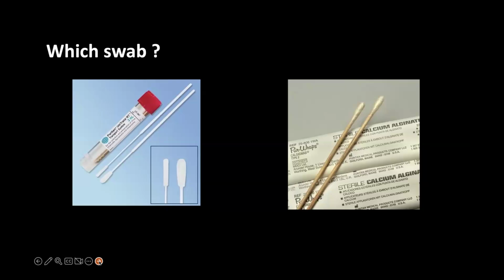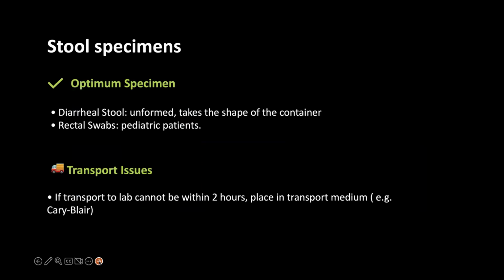And when you are requesting viral swabs, it's important not to use gel as transport media, and rather use viral transport media or send a dry swab. Next slide.